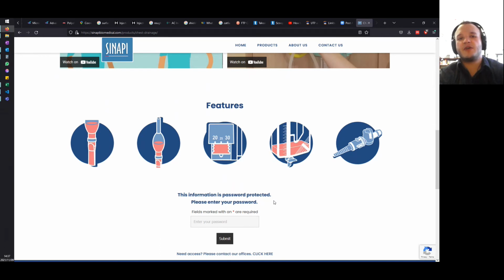So we gave them the conditions the device would be operating in. That's the ambient light, type of lights we're going to be using, the camera setup that we want to use, and this allowed ANSYS to appropriately simulate a base model for us, which we then took a bit further with ANSYS obviously assisting us throughout that process.